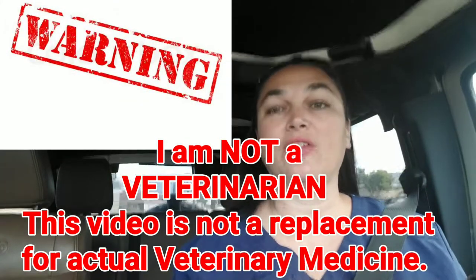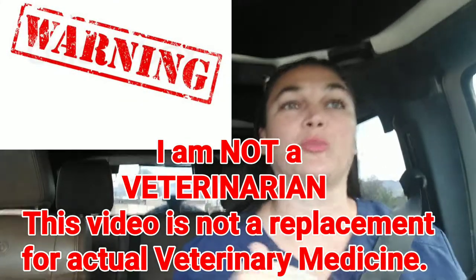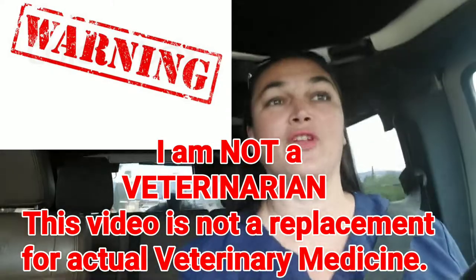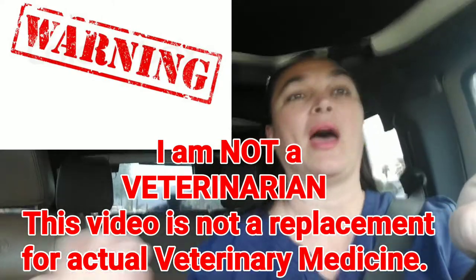In today's video, I am going to show you how I do my puppy shots at home. Like before in my ear cleaning video, I just want to put out there that I am not a vet. I am not a vet technician. I have no veterinary training whatsoever. I was shown by a veterinarian how to administer the vaccines myself and how to mix the vaccines, but in no way whatsoever is this supposed to be a substitute for actual veterinarian care.